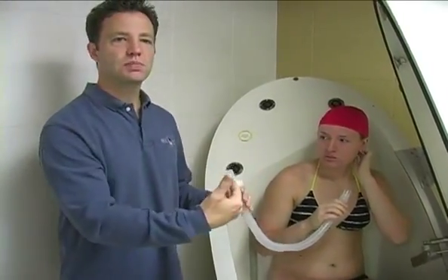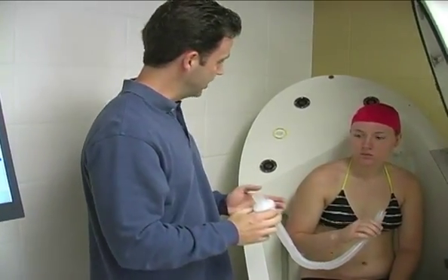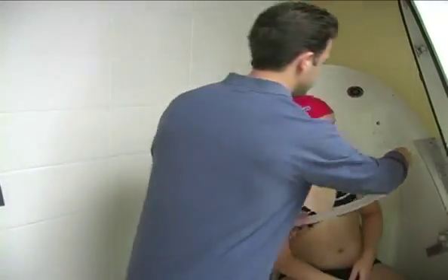The reason I do this beforehand is if you put them in there and they huff, they're breathing freely, and all of a sudden the valve closes, people will take the tube out of their mouth. It startles them because they're not breathing free-flowingly, if that's a word. Okay, so you want to try this? Yep. All right, so I'll attach it here.